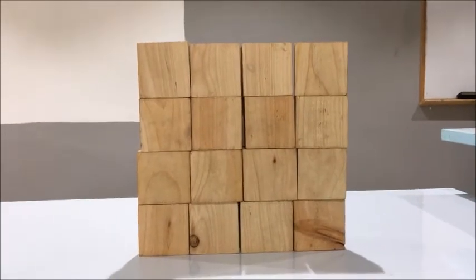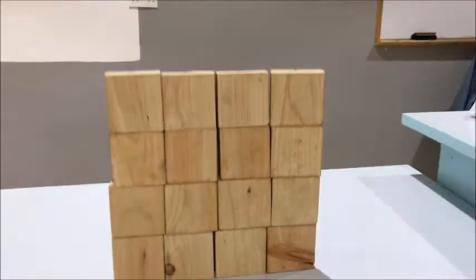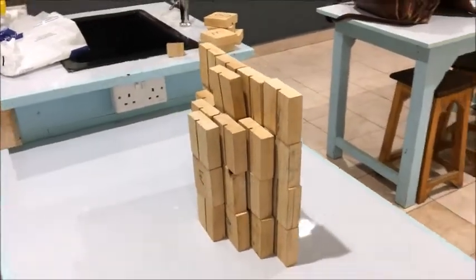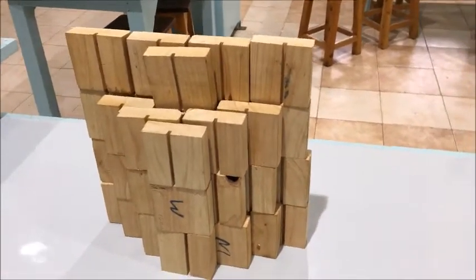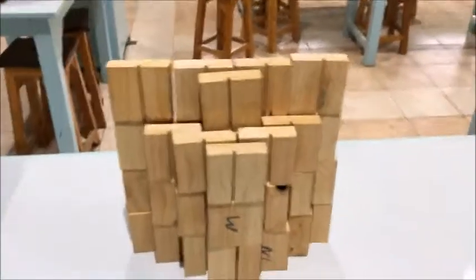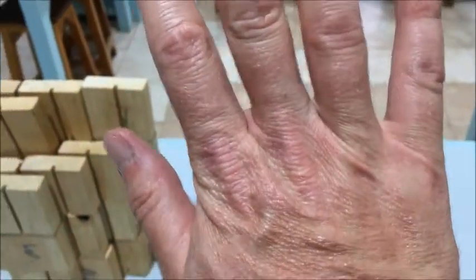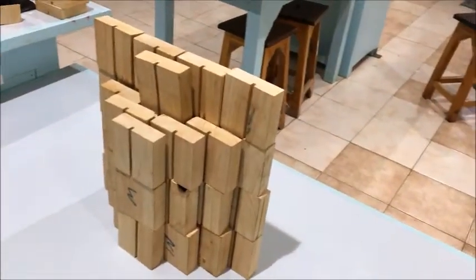Now if I look at this as a shadow image, you can see it's a 4x4 set of voxels, but if I come around now to the back, you can see that it is a three-dimensional image, in fact, and that there are different amounts of voxels making up the shape. You might consider it almost like a hand, like this. If I see a hand like this and I go like that, it's thicker at the back than it is from face on.